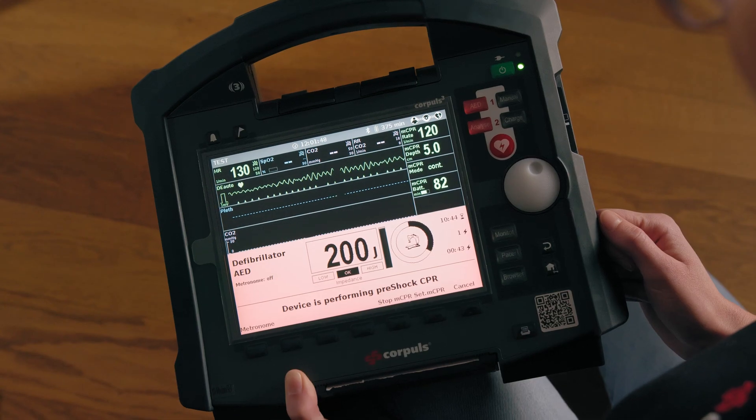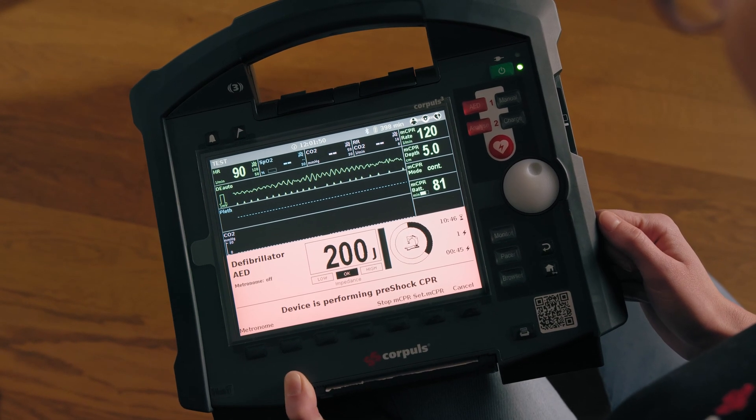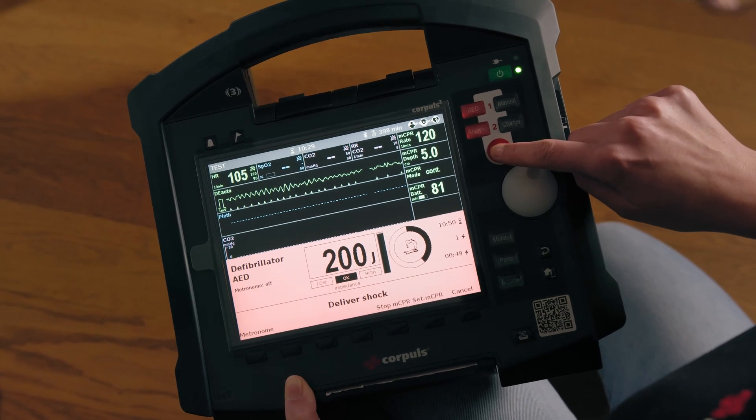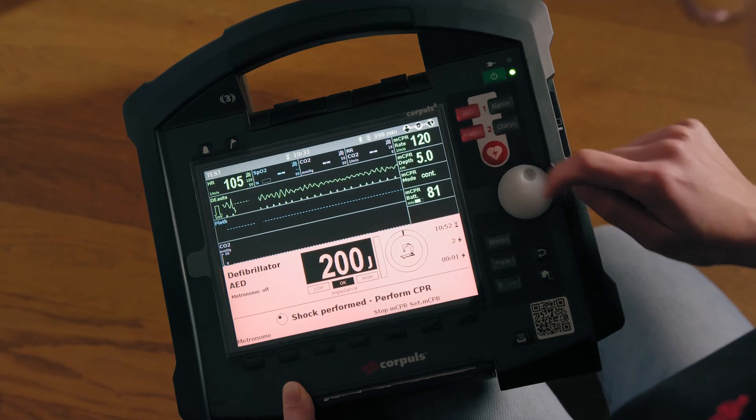Everyone move away from the patient. Everyone is away, then I will deliver the shock. Shock has been delivered. We just did that in AED mode. In principle it is easy because the two devices work completely separately. The only thing to remember is that no one touches the patient during the analysis and during the shock delivery, and that you hold the shock button long enough while delivering the shock and that the shock is actually delivered.